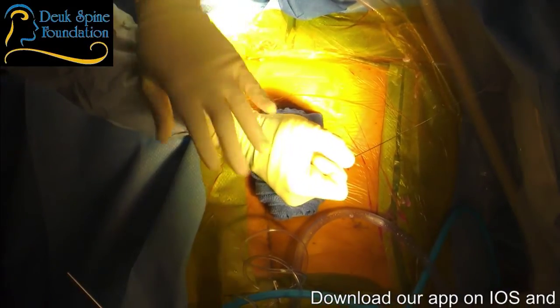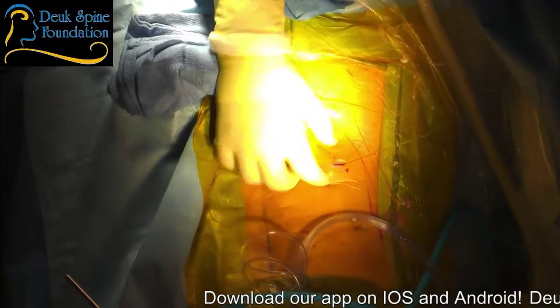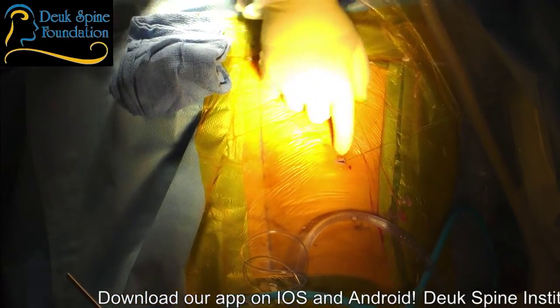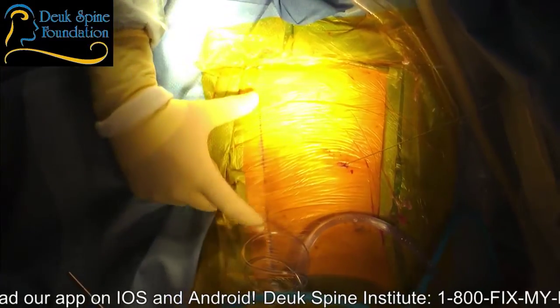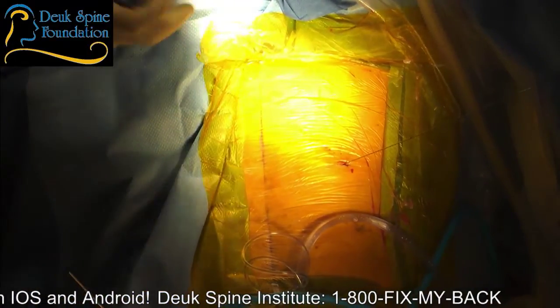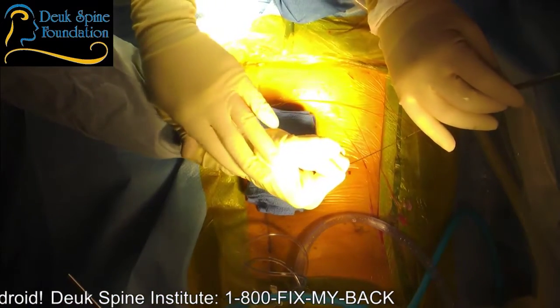Isn't that remarkable? Let's show our audience this cut. Can you see here? Yes, we can. Remarkable. 3 disc herniations, 1 cut. If we did traditional surgery, the cut would be this long, because you're doing 3 discs. And honestly, traditional surgery won't fix this problem.